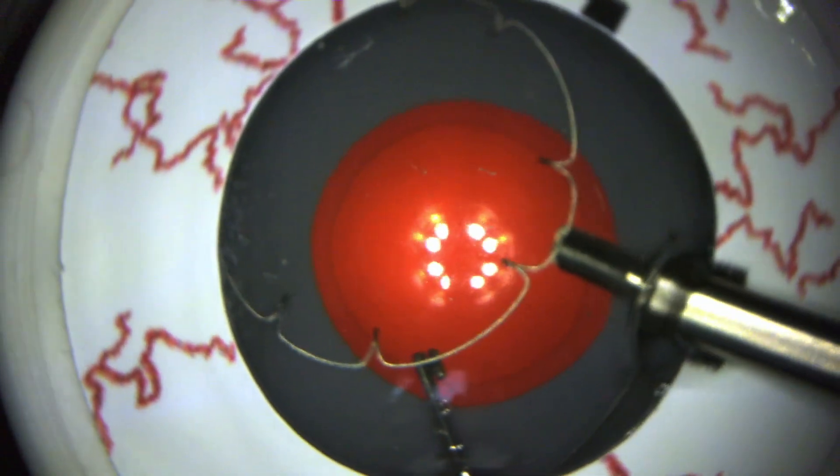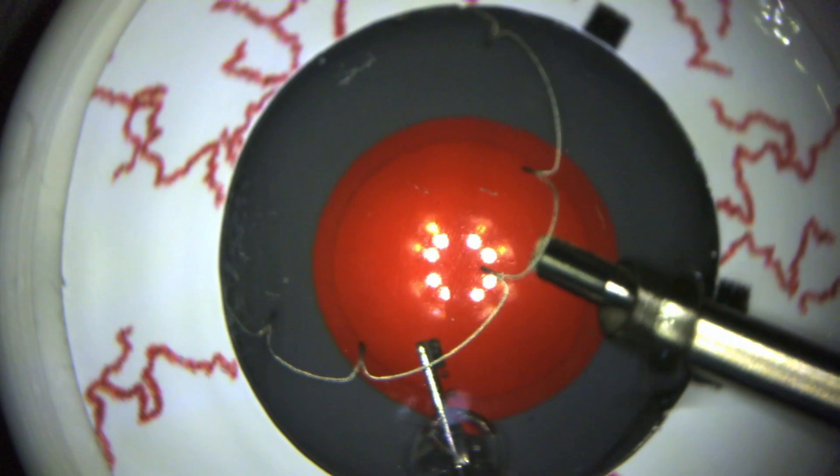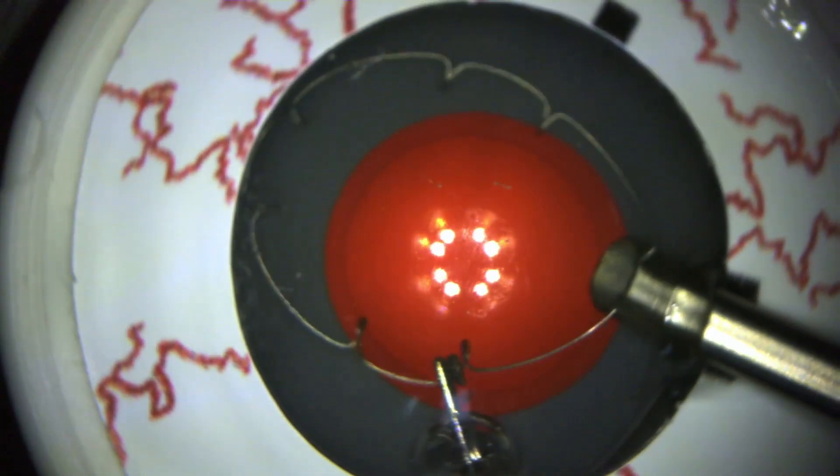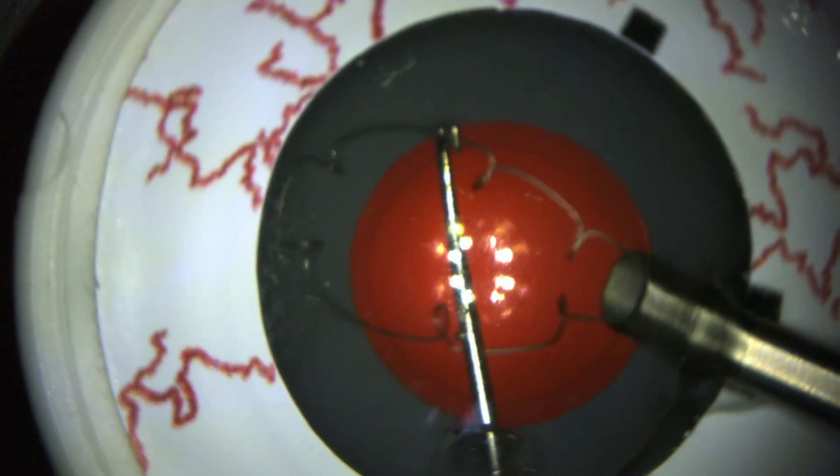Reinsert the injector. Once inserted, advance the plunger to engage and grab the device, using a secondary instrument to help guide the X1 back into the injector. Be sure to leave the injector inside the eye until it is fully retracted into the cannula, then remove the injector.